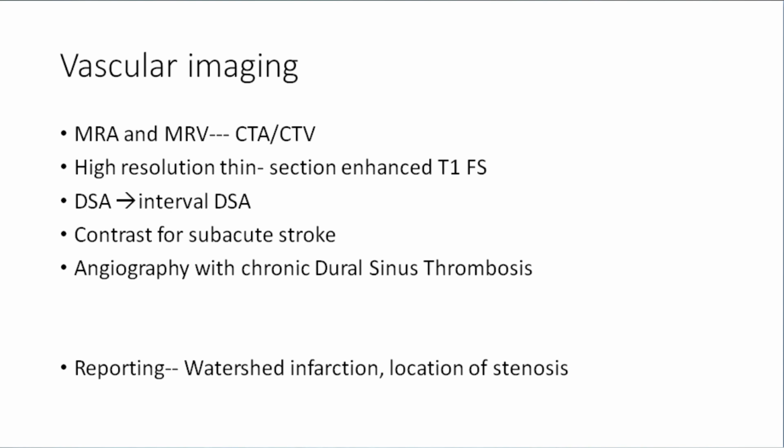You can look at that in the T2 weighted images if other images are not done, if you're interested. Otherwise, you can say some kind of vascular imaging is suggested to look for the critical stenosis. It may clarify because there are close to 250 to 300 neurologists in the country. Okay. We have such a huge population.